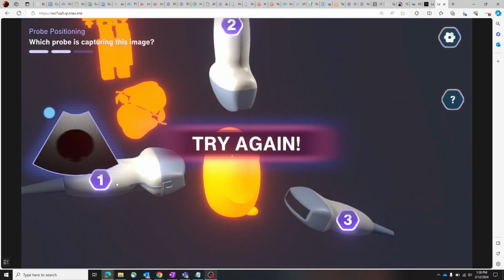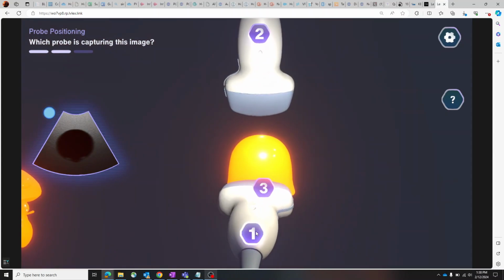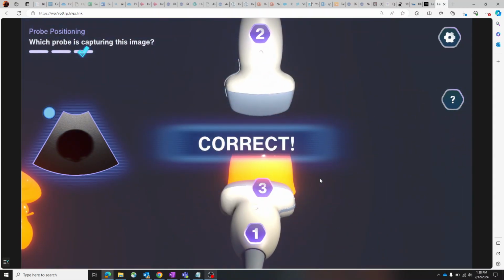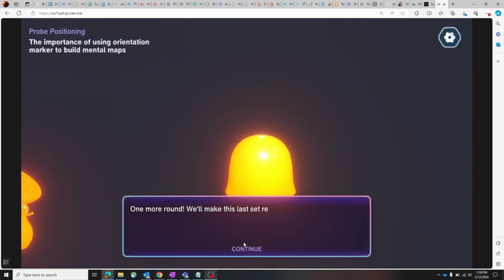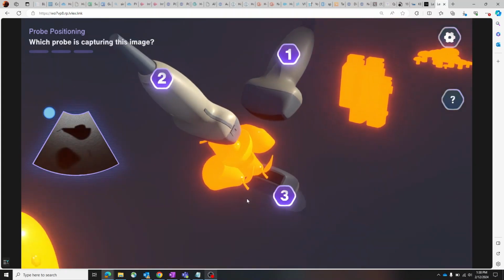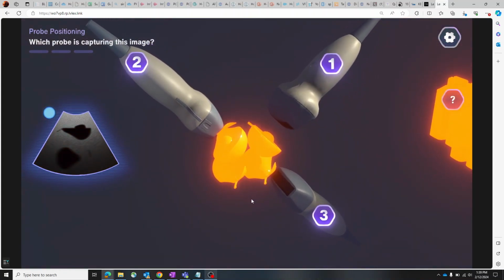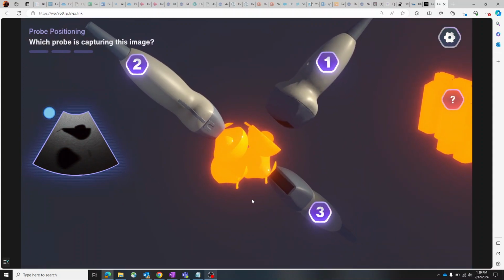We are taking it very seriously, and there are some things that are missing here for a purpose, and it is a linear standardized process also for a purpose, to standardize the intervention among those test subjects, who will be evaluated with and without game performance, comparing the results in terms of image collection in real test subjects. So that will be the next thing.